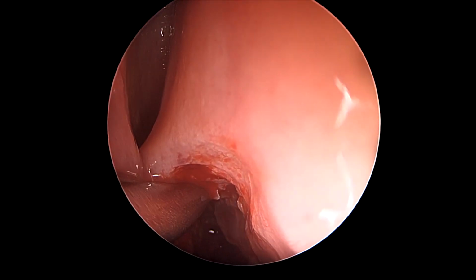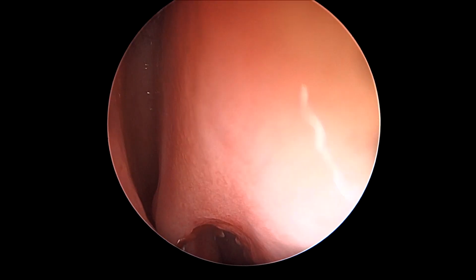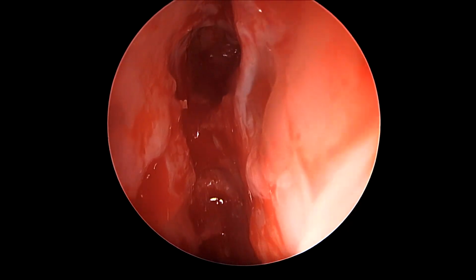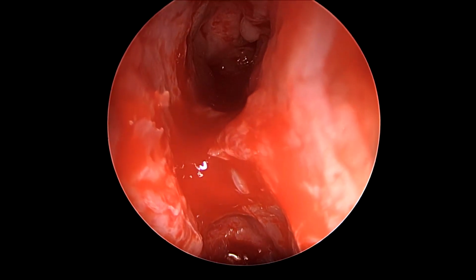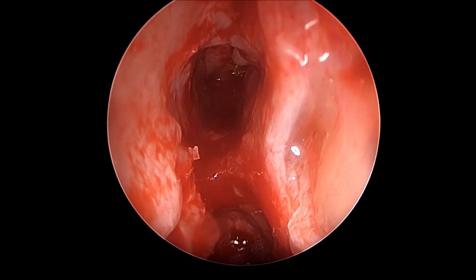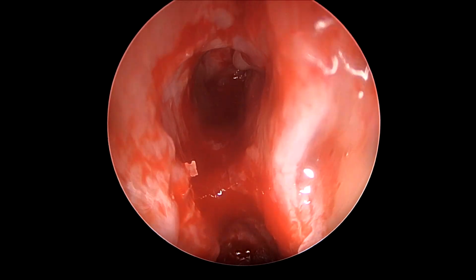Now we use a curved frontal sinus suction, a thin one, to guide our way inside the frontal recess. Of course, one must be mindful never to force your way inside, because that can lead to false tracks and then it would be very difficult to access further. As we can see, now the frontal recess seems to be widely open and we need to identify the cells which were blocking our way inside the frontal sinus.